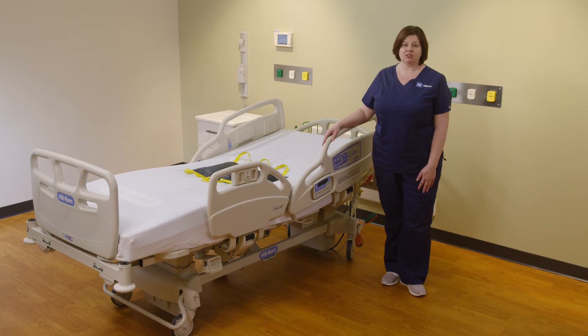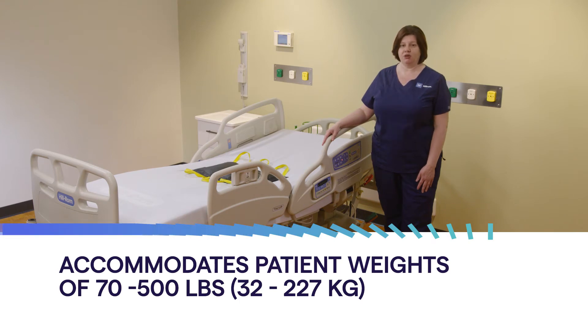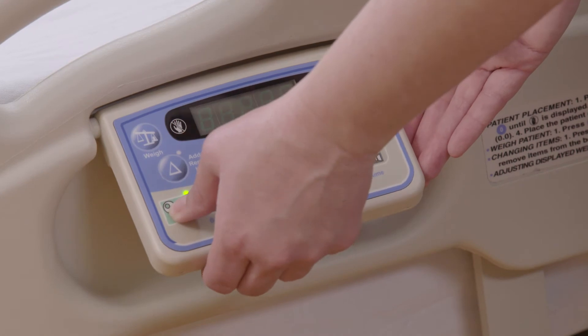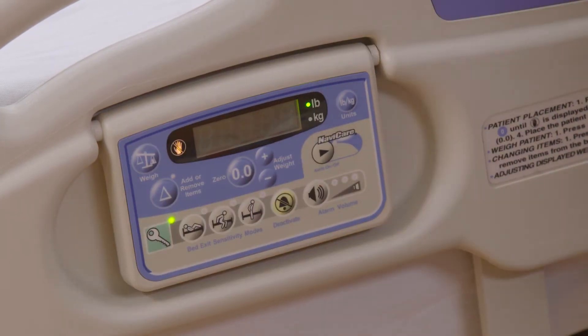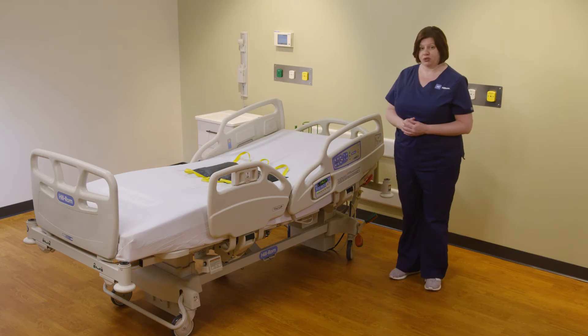We have placed some weights on the bed to simulate a patient. Your Care Assist bed is rated for patients 70 to 500 pounds. In order to weigh the patient, activate the scale pod by pressing the green key, then push the weight button and let go of the bed.